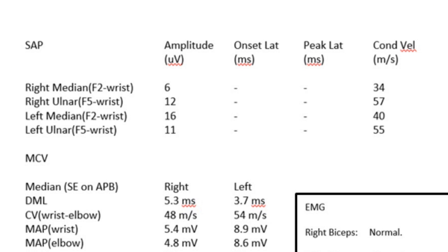This is typical of a demyelinated nerve. The ulnar response over here is 12 microvolts and 57 metres per second — that's perfectly normal. It's above the 5 microvolts and also above 50 metres per second. Let's have a look at the contralateral side for the left finger 2 response.